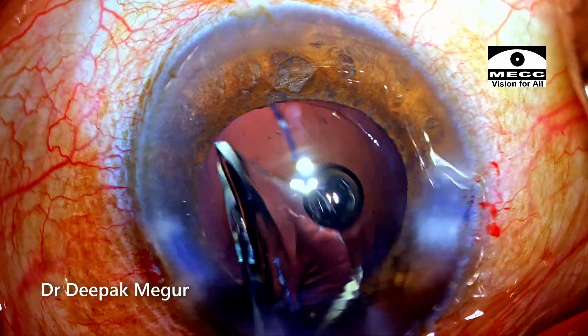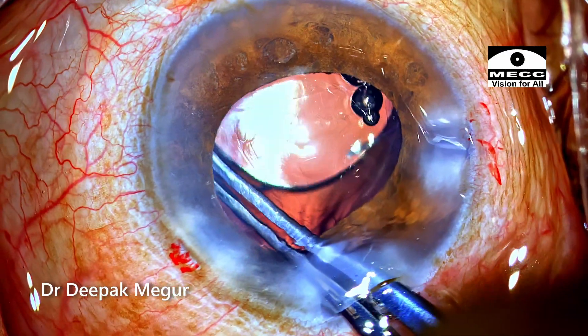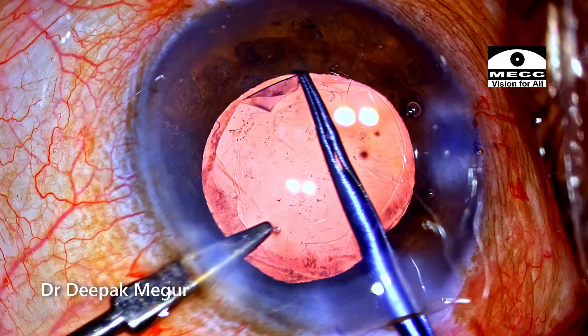A multi-piece hydrophobic lens is implanted into the bag. With the lens inside the bag, it is time to enlarge the rhexis. Using micro-scissors and forceps, the rhexis is enlarged.